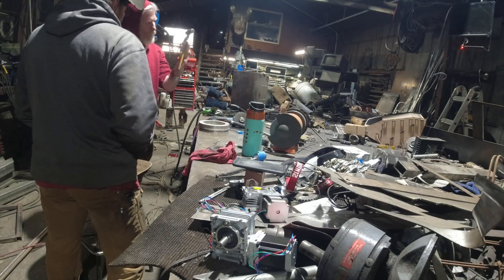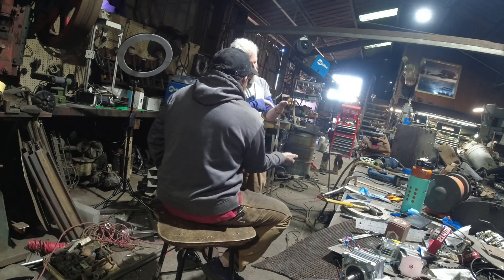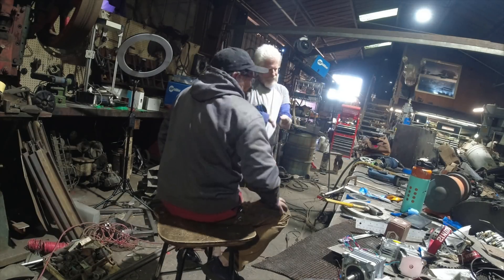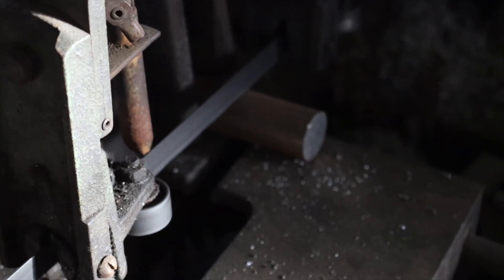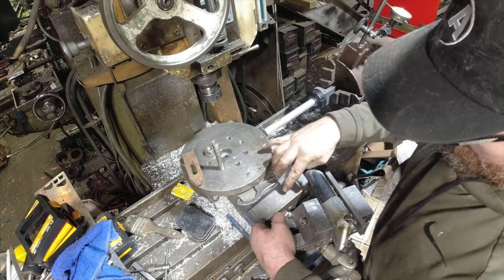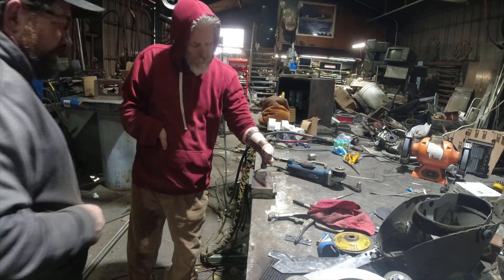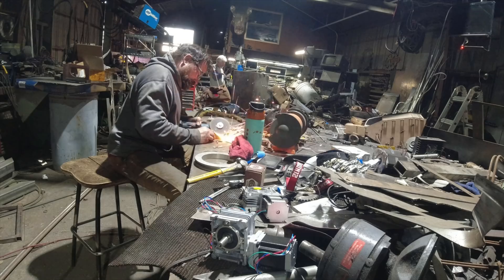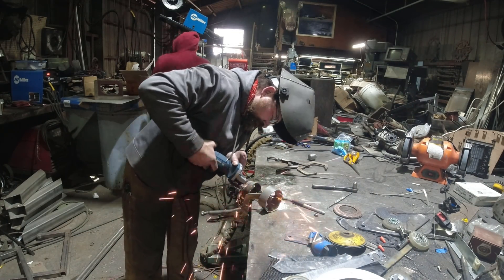Once we had a great fit on the prosthetic, we started talking about if there was anything we could add to help him out in the real world. He said he's always using that part of his prosthetic as a hammer when he's building stuff, so I said, great, let's just weld a hammer head to the bottom of your prosthetic. After a bit of back and forth, we settled on a rough size and weight for the hammer. I went out to the bandsaw, grabbed a piece of 1045 ground, cut a slot in it over on the milling machine, and then tacked it to the bottom of the fork. Then, as with the other pieces, we had to test the fit — tapping it on stuff, checking the angle, cutting it off, welding it back on — getting the angle to where when he would hit it on something it wouldn't end up torquing his wrist.